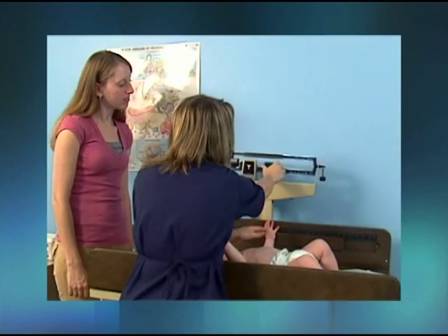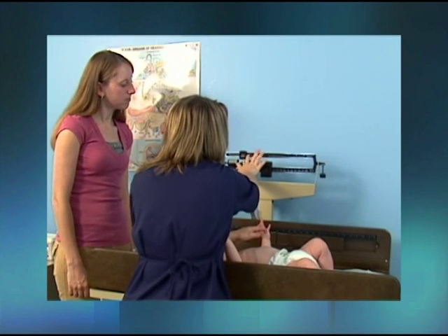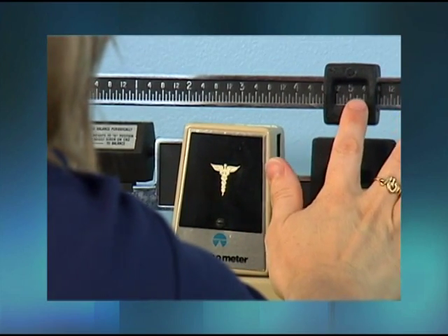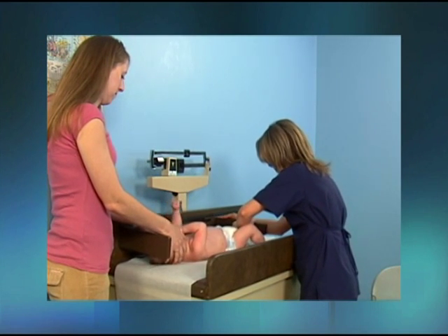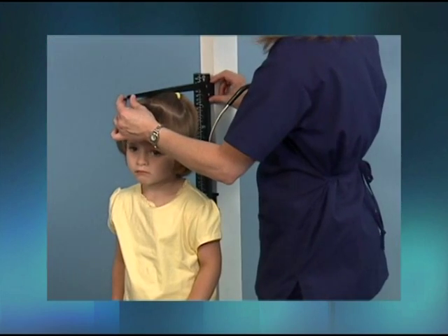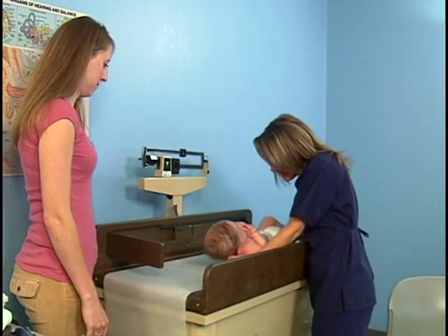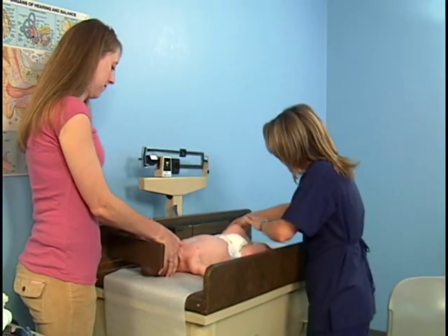procedure. During both well child and sick child visits, the medical assistant must measure the child's weight. The weight of a child is used to determine nutritional needs and the proper dosage of medication to give the child. The length or height is also measured during the visit. Length is the measurement of the child in a supine position, while height refers to the measurement of a child in a standing position. The medical assistant will show you how to measure the weight and length of a 4-month-old pediatric patient using a pediatric balance scale.